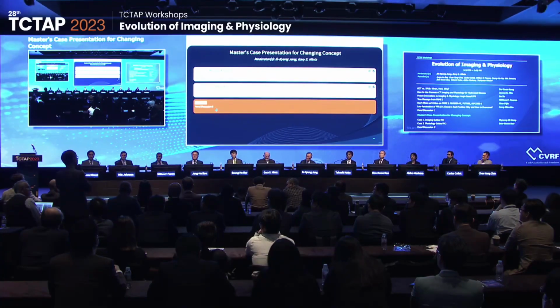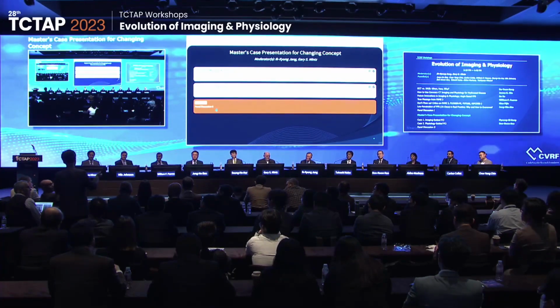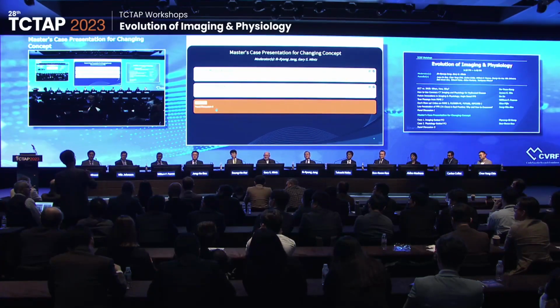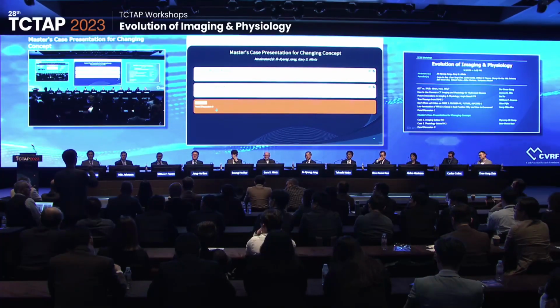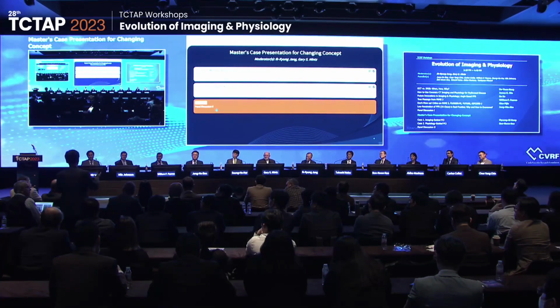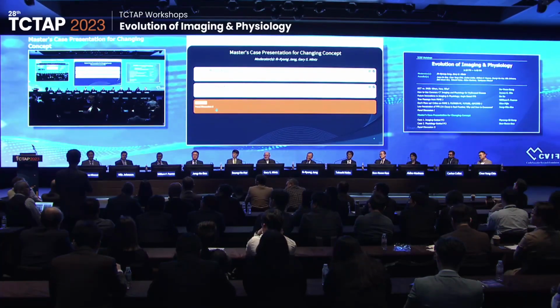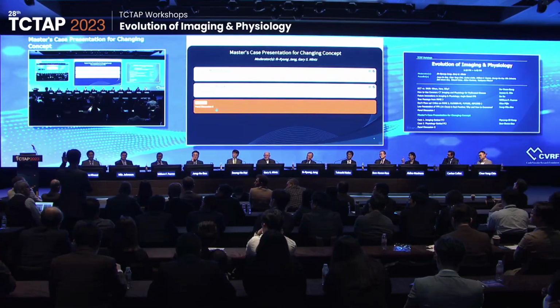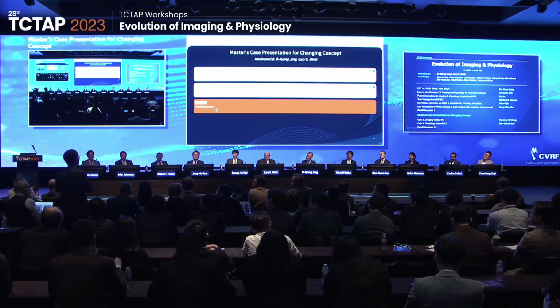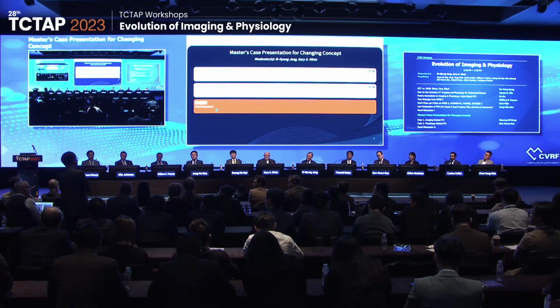So that is one of the reasons why we do so. Based on the physiologic study, when the lesion looks undetermined, whether to do PCI or not, in that case we do a physiology test to clarify the characteristic. But for a very tight narrowing, why would we do a physiology test? It's clearly because we already learned from our long PCI career. So that is why we do so far.